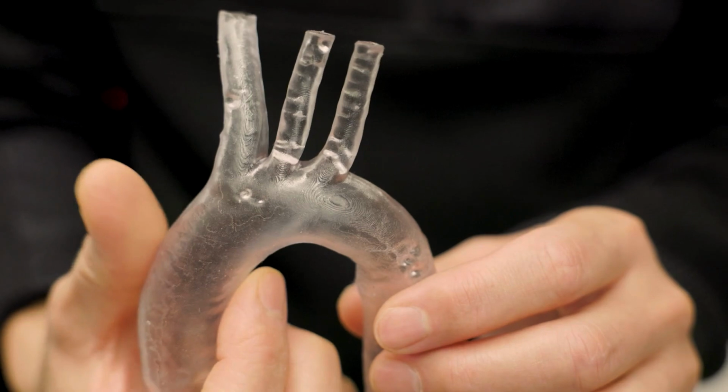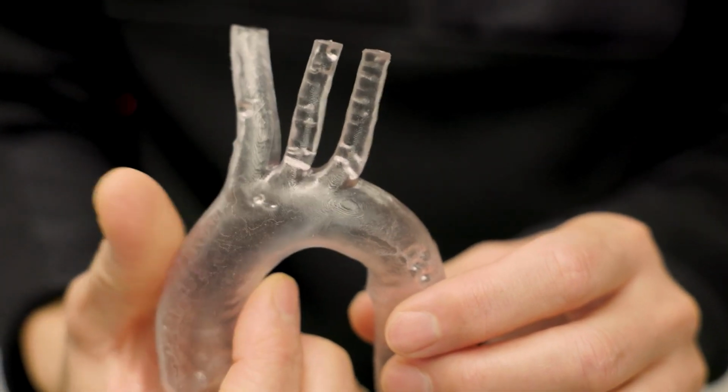When a new innovation comes, we all get excited and talk about it. And if it is related to health, particularly cardiovascular, that really steals all my attention. One of those innovations going on right now is a biodegradable graft, which will be used to replace the blocked or damaged arteries to combat cardiovascular disease, which is the leading cause of death worldwide.